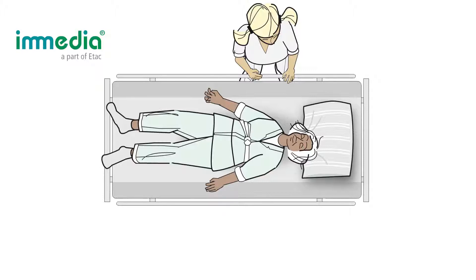Immedia MultiGlide makes it possible for one caregiver to reposition a user that has slid down in bed. Properly adjust the height of the bed according to your own height and put down the gate on your side.